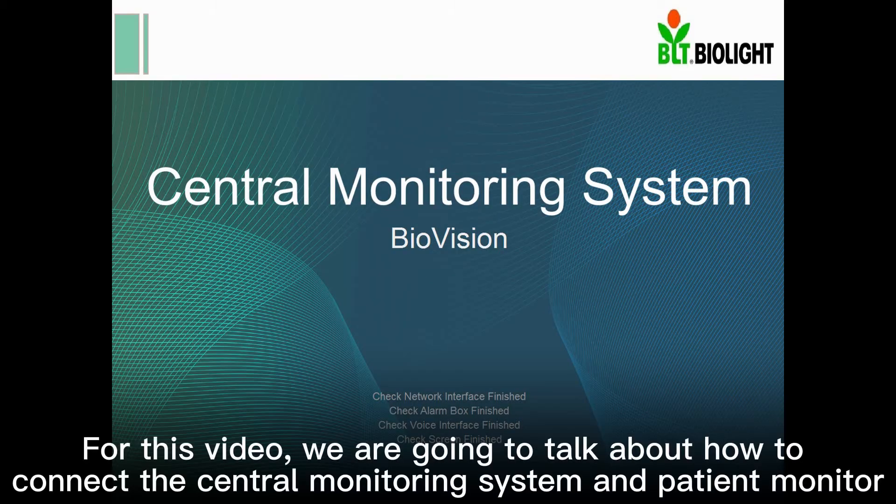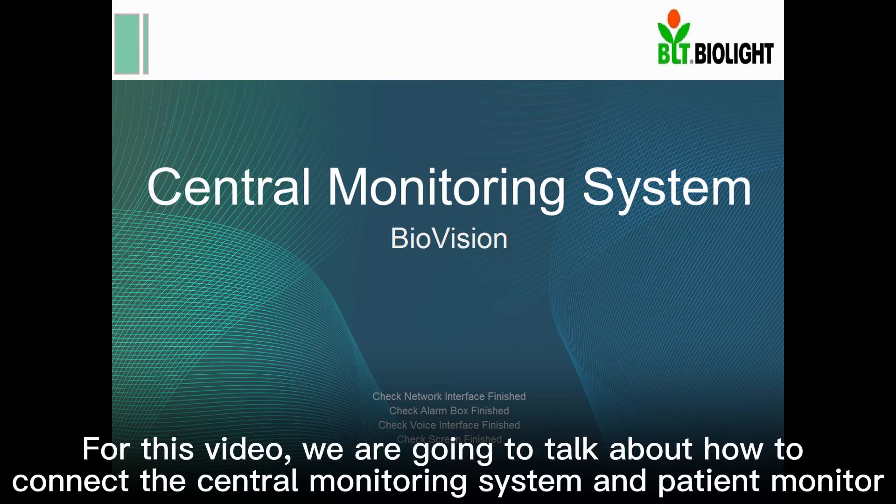For this video, we are going to talk about how to connect the central monitoring system and patient monitor.